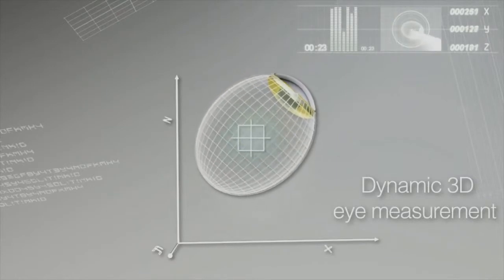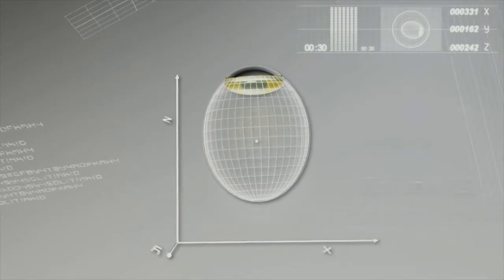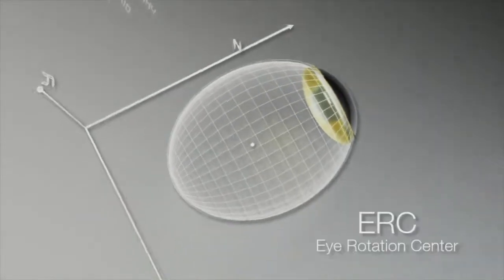This dynamic 3D measurement determines the exact spatial position of the eye rotation center, also known as the ERC.